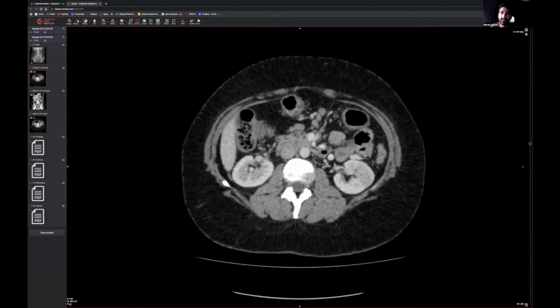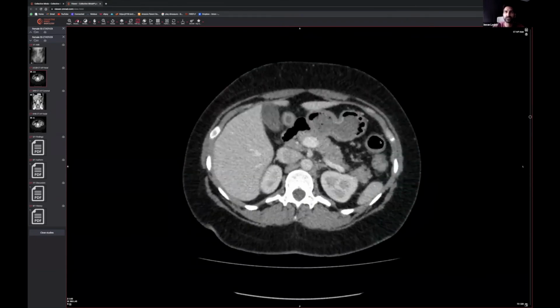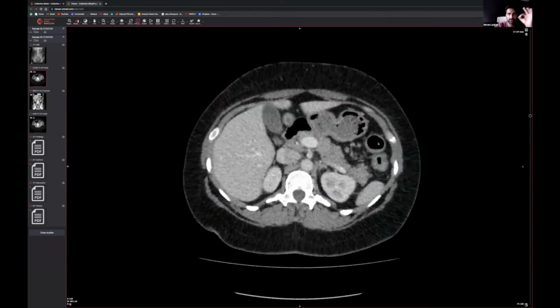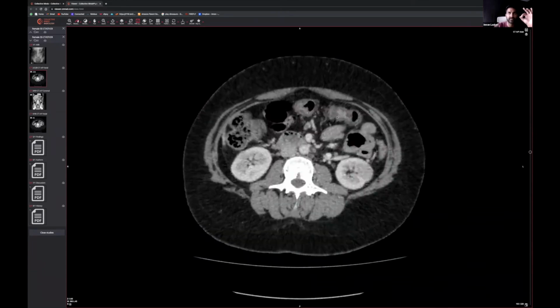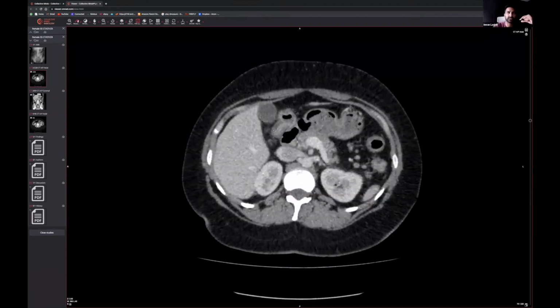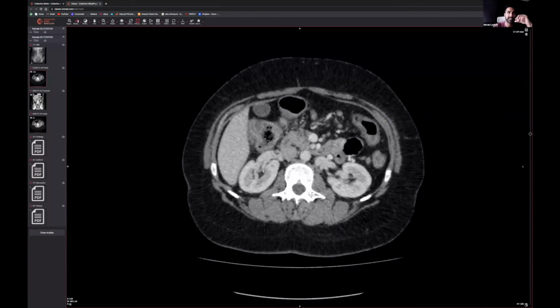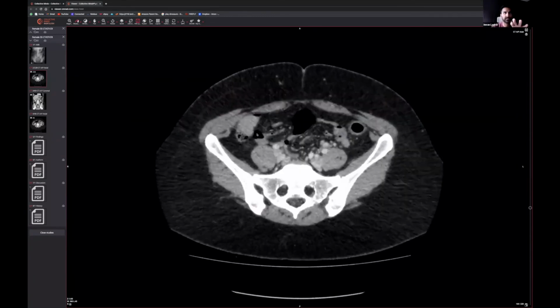I can't remember what they are, sorry, but you can see this doesn't have that appearance, and especially when you come up to the transverse colon, it just looks like a cylindrical pipe, right? And you can see that going along like so. It doesn't have very many features. It looks quite inflamed, and it looks more and more inflamed as you go along this way, all the way along here, and then it starts to have more of a normal appearance within this region.